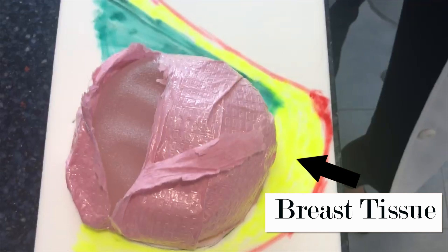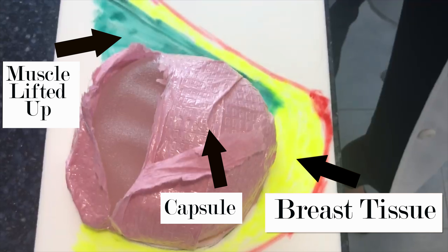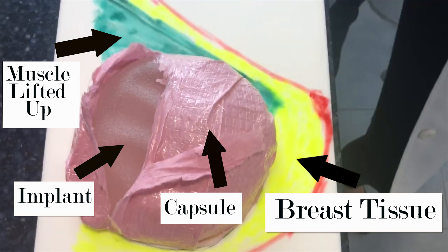This is the muscle lifted up because it's no longer attached down here. Most of you have implants under the muscle, which is dual plane — partially under the breast tissue and partially under the muscle. This pink represents the capsule, the scar tissue around the implant, and inside here is the implant.